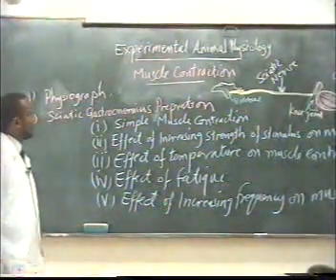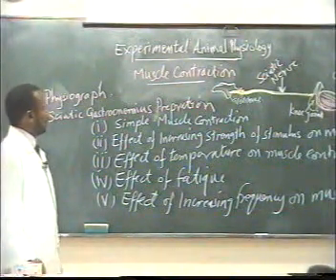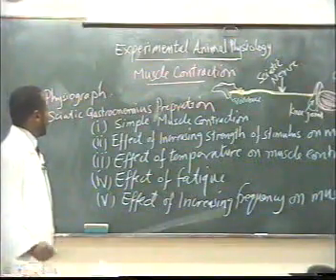These practical classes, which deal with experimental animal physiology, usually start with the demonstration of experiments on muscle contraction.